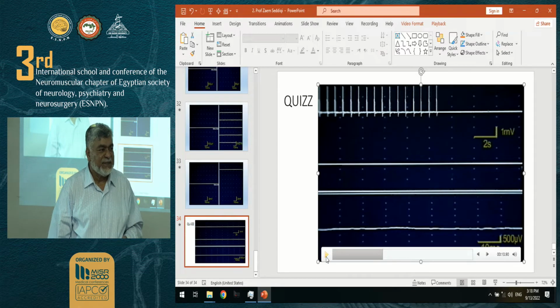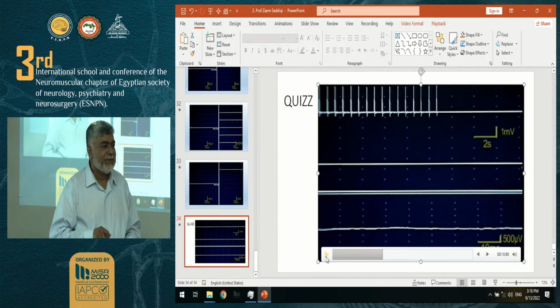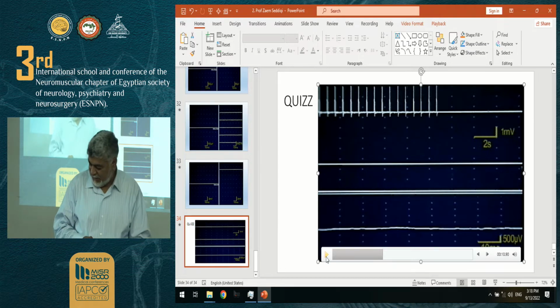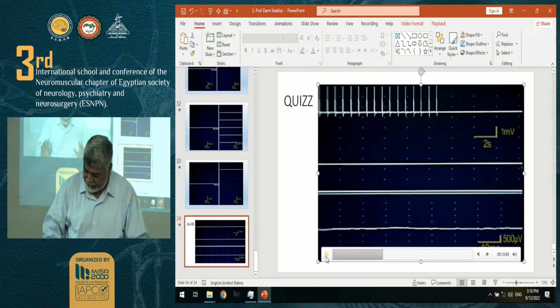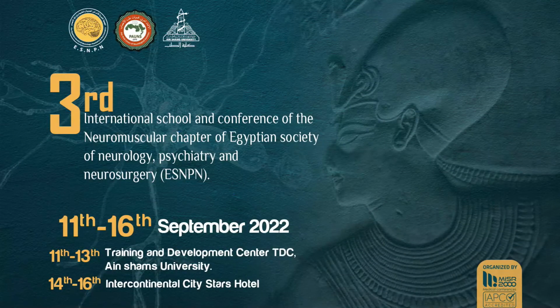There are a lot of artifacts, but I think, any questions about all the things we covered? Good? Are you good? Thank you, guys. Maybe some other day I can show you H-reflexes and all the stuff. There's a lot of stuff to see. You know how much you can cover in one day.